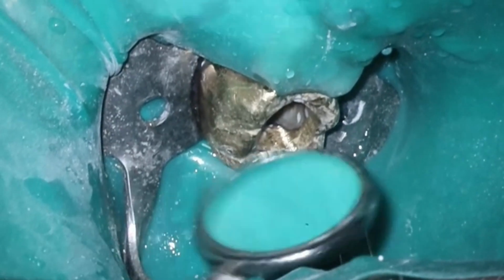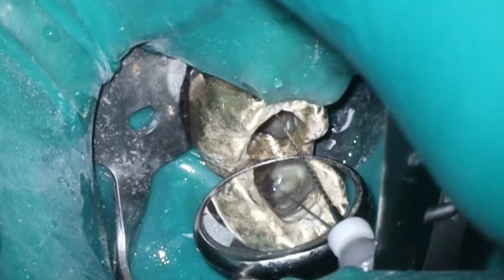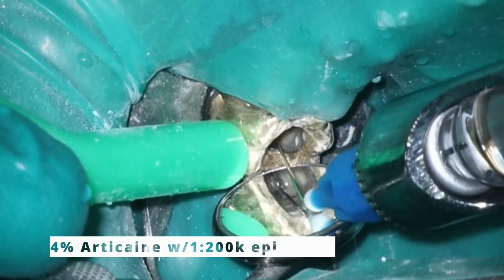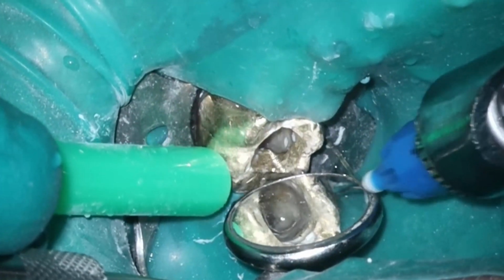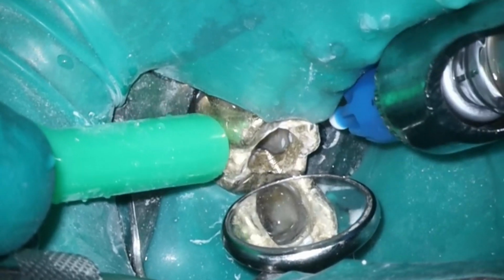But anyway, the fun fact is the tooth is still vital. You'll see him jump here in just a second. And unfortunately, that means something went wrong here. So I ended up doing some intrapulpals. It took a while to get the tooth all the way numb. But here's the thing. How can you have a vital tooth and have lesions? Think about that for a second.